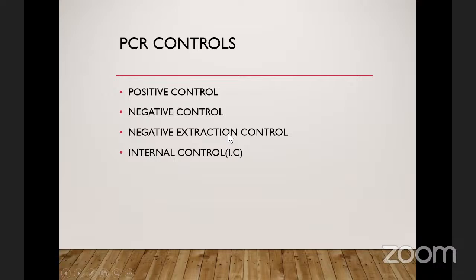Even right from sample packaging, putting 2 samples, 3 samples together and sending to the lab, you can have a highly positive sample among those samples, and then there's a leakage and it just touches the cap of the other samples. It can actually give you false results. And we talked about how you can use your sample acceptance and rejection criteria to actually correct all of that.